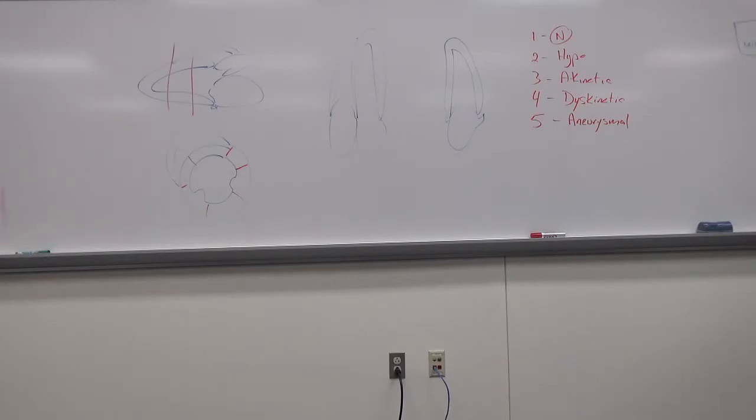So tell me what are we looking for in a stress echo? What's the goal of doing this? Whether there's changes post-exercise. Okay, what changes specifically? Ischemic changes. So when we talk about ischemic changes, what do we want to know? This is why we learn the wall segments. Focal. We want to know what coronary artery supply we're talking about. So you need to correlate what coronary artery is associated with each of those segments.